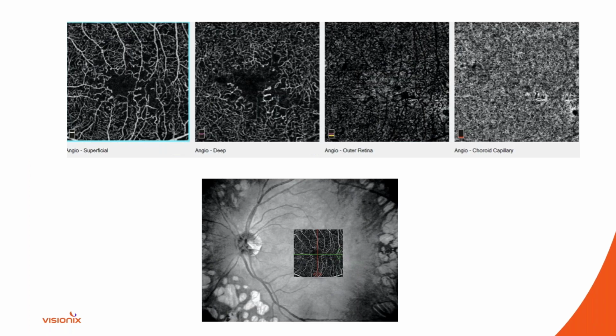And this is the other eye, very similar to the right eye, the same thing, just a very anomalous appearance to the fovea, the area surrounding the fovea, lots of capillary looping and telangiectatic anomalous vessels.